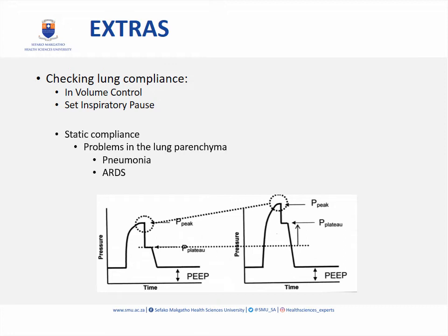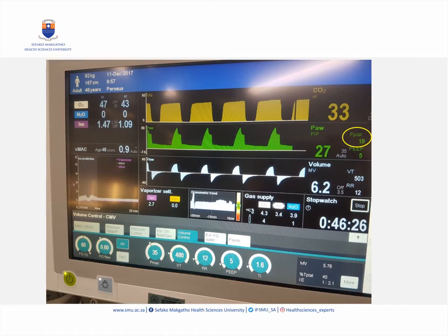Okay, so I'm going to show you just a picture of where this is demonstrated nicely. So patient in volume control mode with an inspiratory pause set up, and here we can see the plateau pressure numerically and the little inspiratory pause. Okay, good.